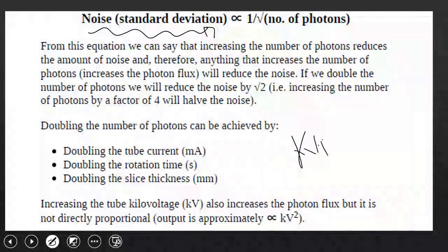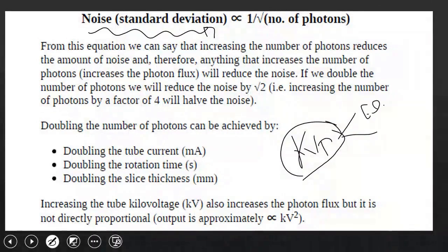If the filament current increases, what does it mean? You remember we talked about this: it is what heats the filament and produces a larger quantity of electrons.